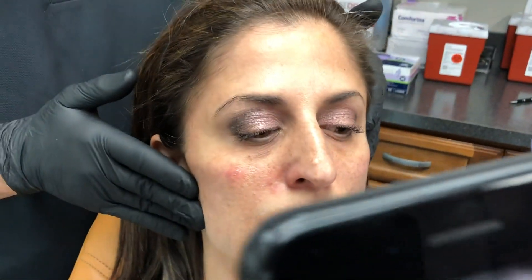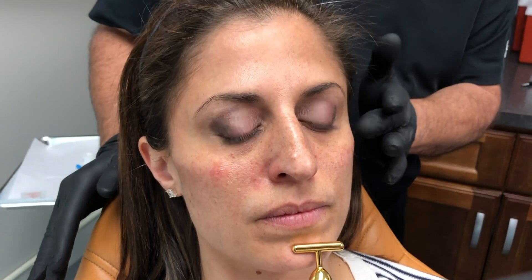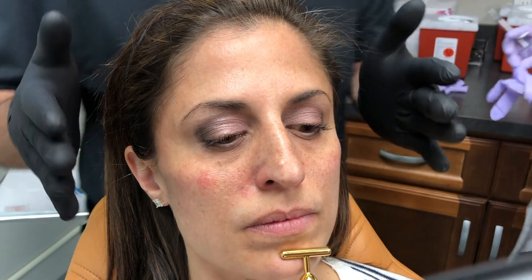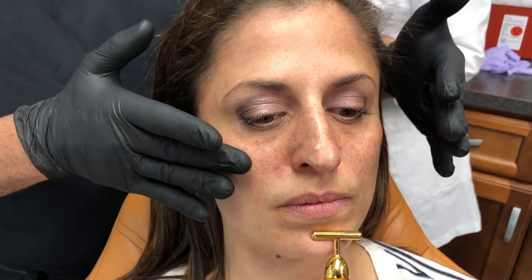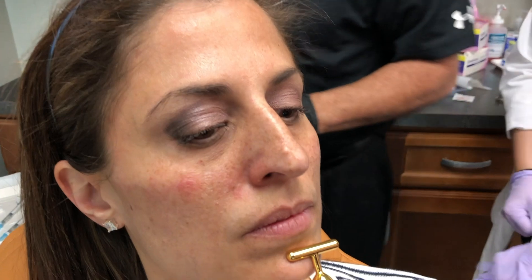She's looked at the patient from different angles and that is looking really good. This cheek took a lot more of a Voluma syringe — this one took about 0.7 of a syringe, and that's a really important point. People are asymmetrical; this side may have responded a little less initially so we needed a little bit more product. But that is looking good — let's clean her up a little bit and then we're going to show people how we manipulate this to smooth everything around.